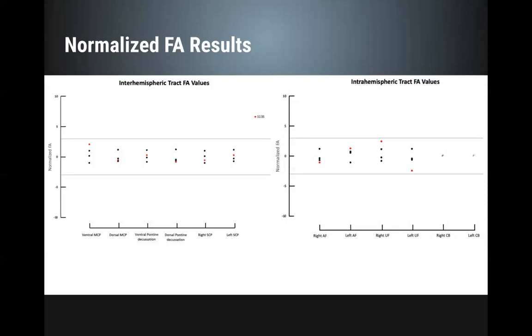Okay, we didn't do the cingulum because we're having trouble identifying the exact track in the agenesis patient. Once we isolate that track, we'll show you the results for that. But now we have the FA analysis. Looking at the FA analysis, we don't see the effect of higher FA values in the interhemispheric fibers anymore.